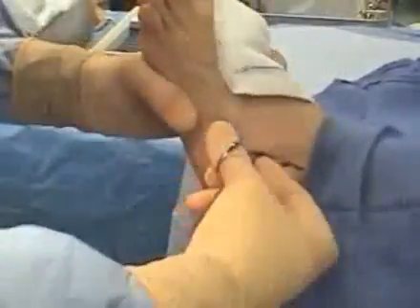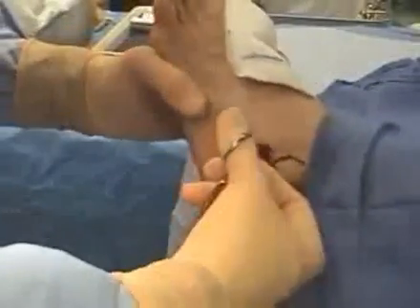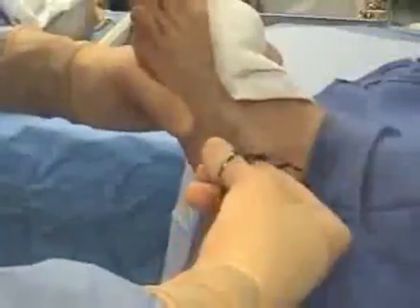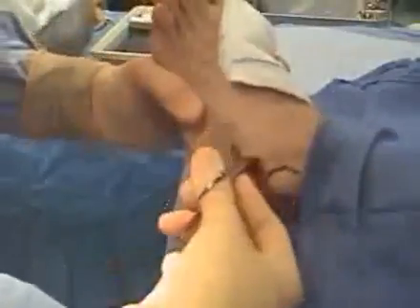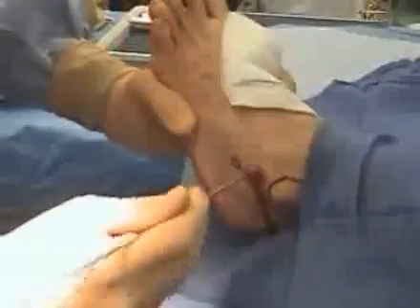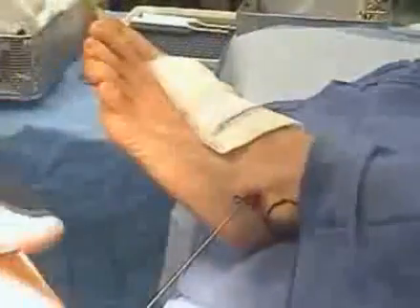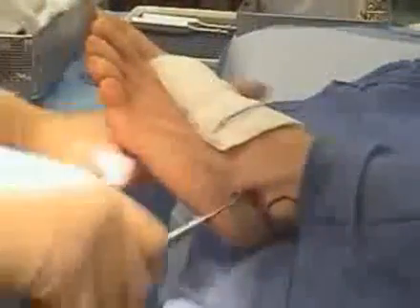Don't do any undermining. This next part is very important, which we'll see again in a little bit: cut the structures within the sinus tarsi. This will then create nice bleeding edges, so when we insert the stent, the ligament will heal back together around the stent, which helps to incorporate it and helps to prevent displacement. After this, we'll insert our guide wire, and we want to feel the tip of that medially, and remember again the angulation that we have.